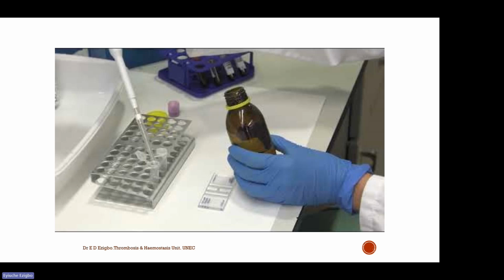That calculation is also done manually. All this whole process, the automated machine can produce results, all the results, in less than 1 minute.